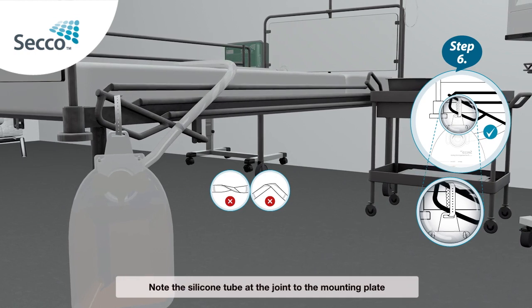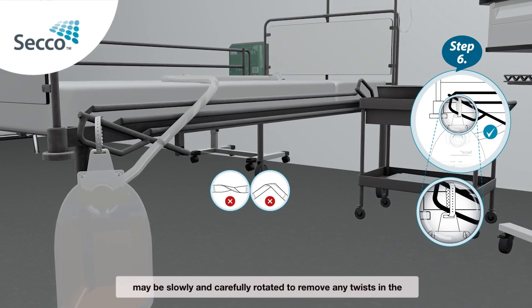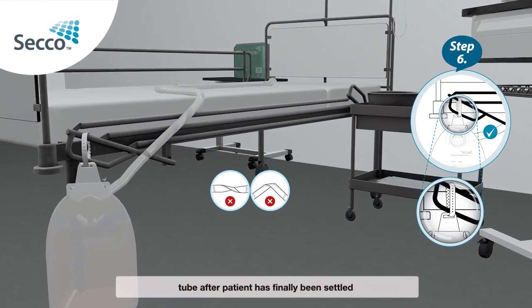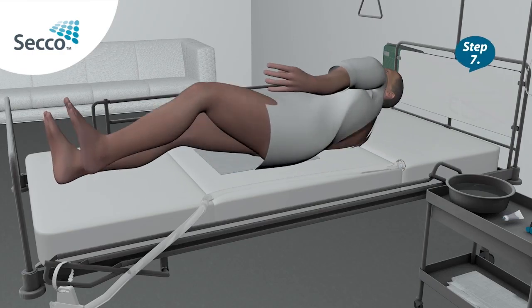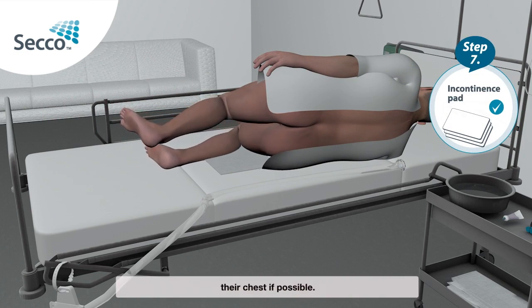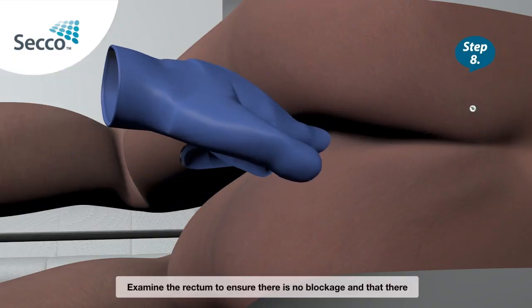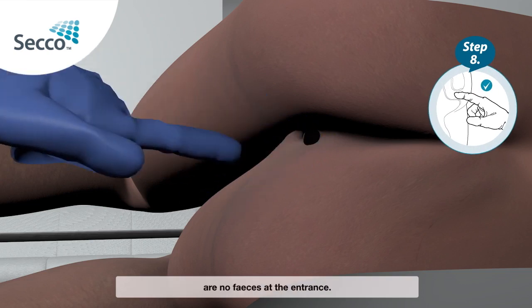Note: the silicone tube at the joint to the mounting plate may be slowly and carefully rotated to remove any twists in the tube after the patient has finally been settled. Step 7: Put an incontinence pad underneath the patient and roll the patient onto their side with their knees towards their chest if possible. Step 8: Examine the rectum to ensure there is no blockage and that there are no faeces at the entrance.